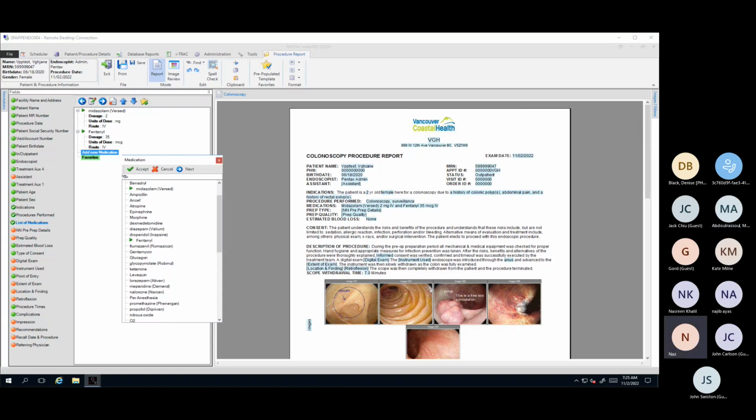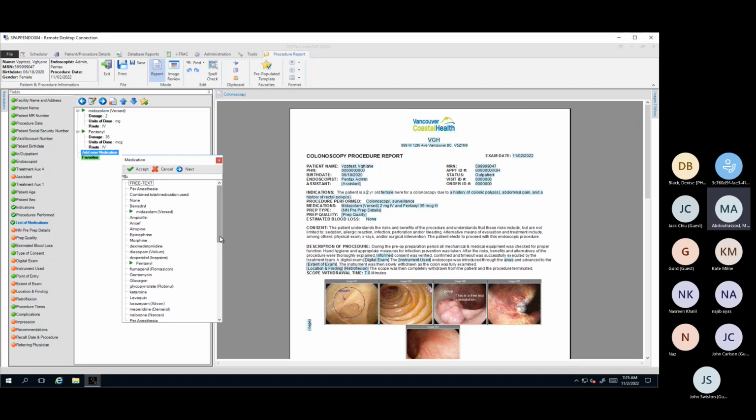Yeah, there's no Buscopan, which a lot of us use quite routinely. I don't see it. Sure. You know what? I can have that added for you. Could you maybe send Denise an email with exactly what you need for Buscopan, preferably by today, just because we're going live on Monday, and I'll get that in for you. Okay, I'll send it right now. Perfect. Thank you, Ness.